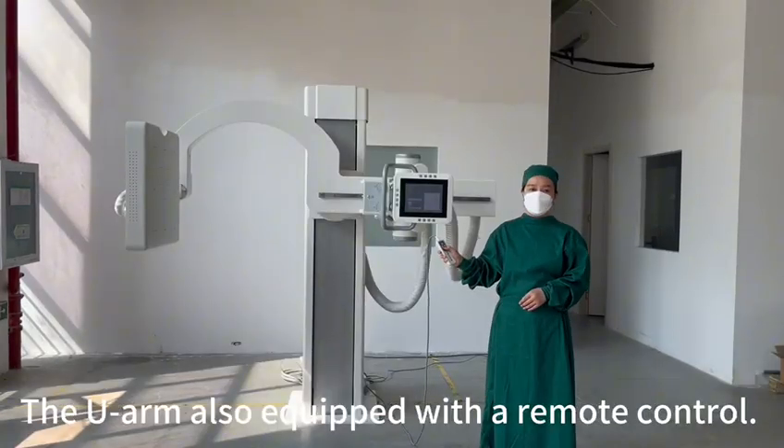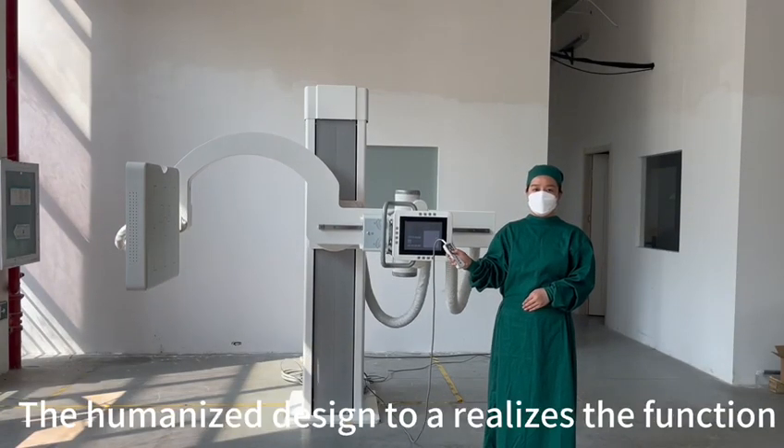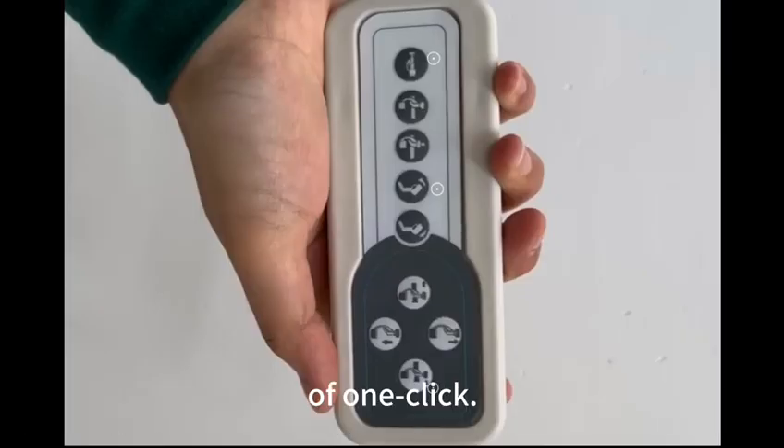The U-Arm is also equipped with a remote control. The humanized design realizes the function of one-click operation.